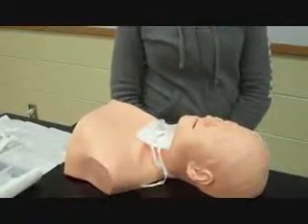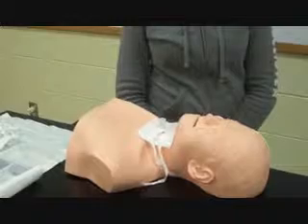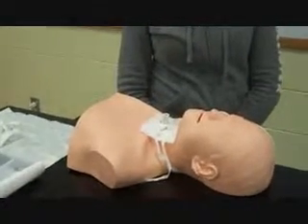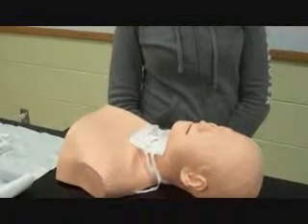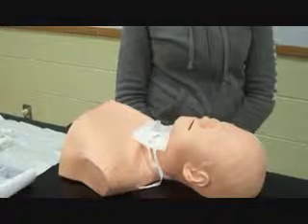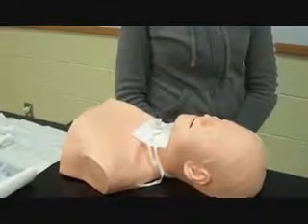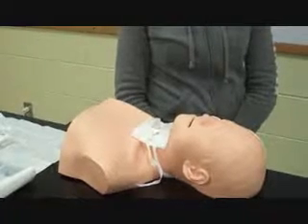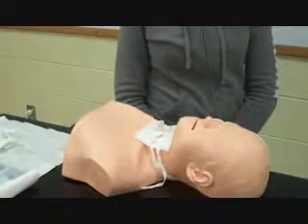So now as you're done with the procedure, you will follow up with the patient and check for breath sounds, respiratory rate, heart rate, and make sure that the patient is breathing at an appropriate level. And then you would wash your hands and order an X-ray to make sure that the tracheostomy tube is placed in the right place. And you would make sure that the patient has adequate humidification. And then you would be done with the procedure.